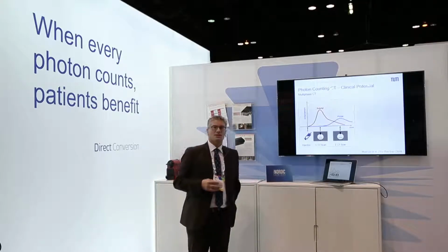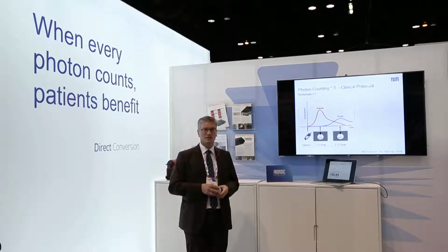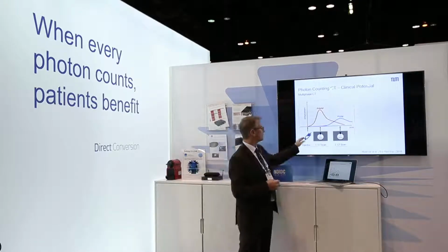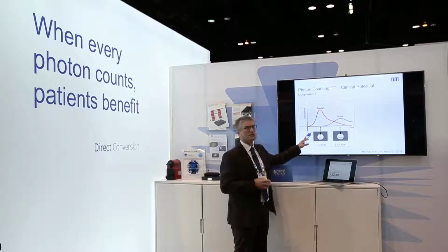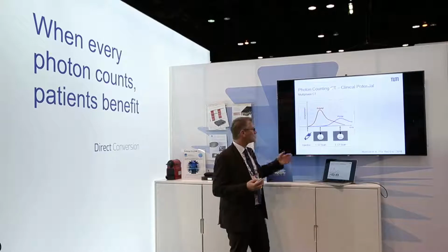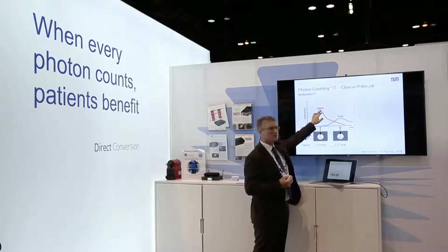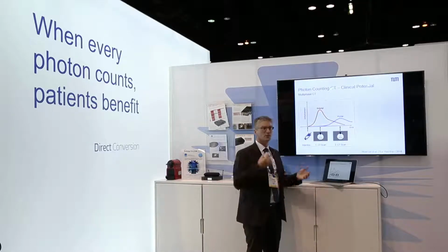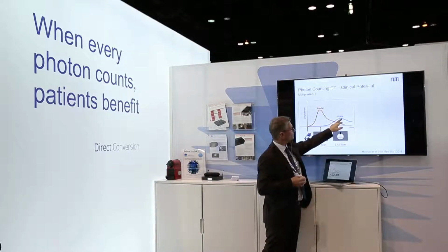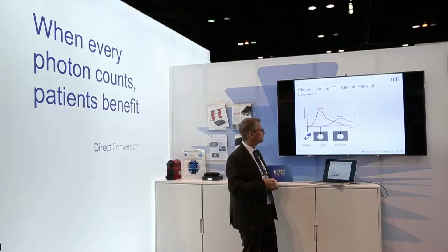Other applications that have been investigated are connected to something that is called multiphase CT. What is multiphase CT? In clinics, very often one gives a contrast injection. If you, for example, have a tumor or lesions in the liver or any other organ, this contrast is distributed in the body, first in a so-called arterial phase, so that's the first blood flow through the system, and then later, if it goes through the heart and comes back through the liver, it has another so-called circle, it's a portal venous phase.